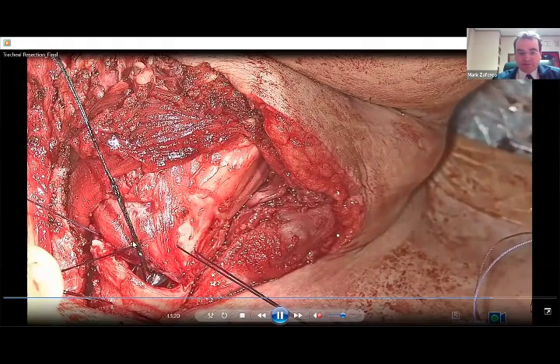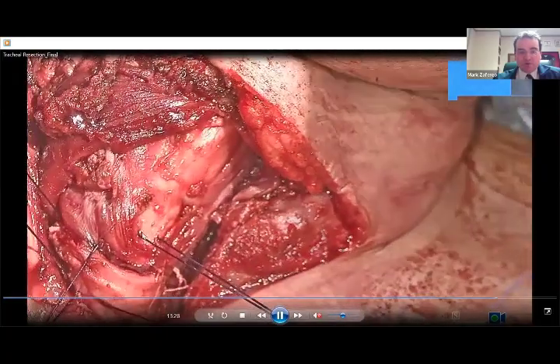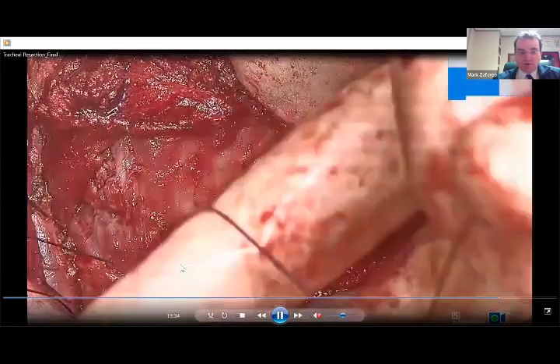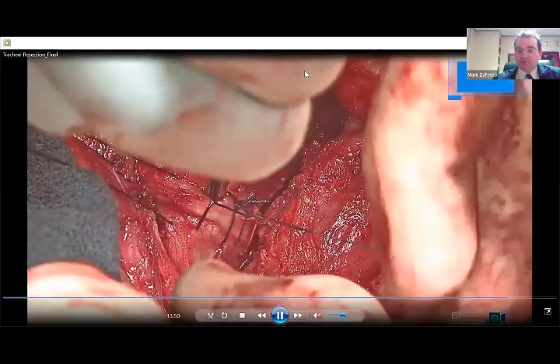And then you put these anterior stitches in. I typically go through 2 tracheal rings here for these anterior stitches just to give it more strength. And I go completely around the cricoid. I do not try to go through the cricoid because the cricoid will crack sometimes if you do that. So that's mostly what I wanted to show. I often put some kind of a muscle flap, either strap or sometimes the sternal head of the SCM, or sometimes a pec flap in really major cases, over the closure. So that's basically what I wanted to show today.